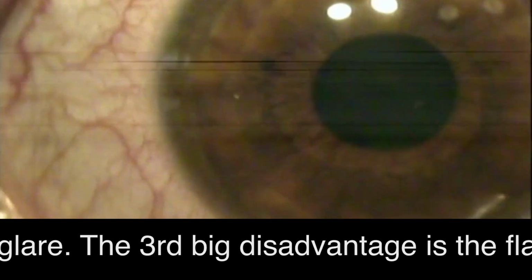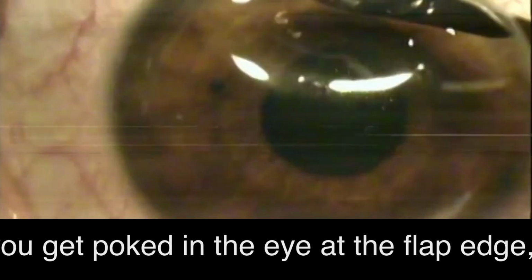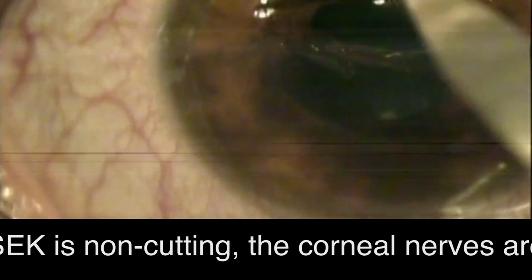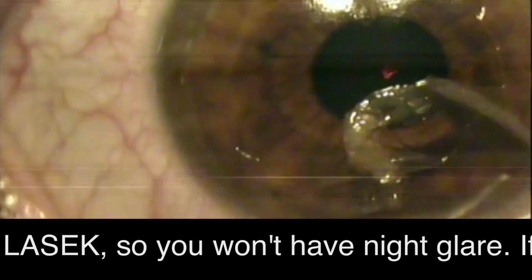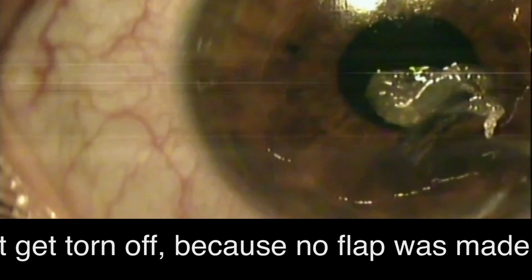And now I'm going to use what's called a hockey stick, or it's like a spatula. It's not sharp, okay? So we're just pushing aside the skin of the eye. And the goal in the end is to get smooth borders, as much as possible. You can see some of these borders on the left are going to be pretty good, and then on the right they're not exactly perfect, but still it's much better than a regular PRK. We're just scraping off the epithelium and not having smooth borders.